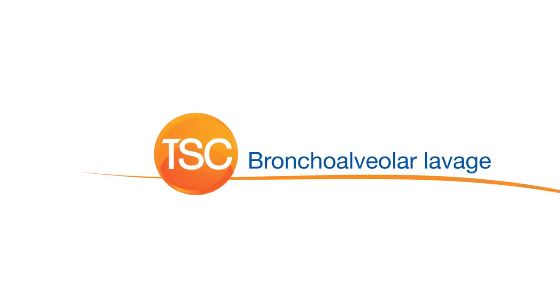The BroncoFlex can be used to perform a BroncoAlveolar Lavage, or BAL.